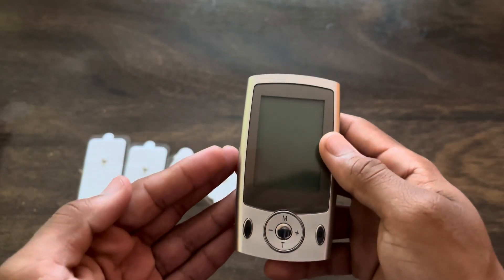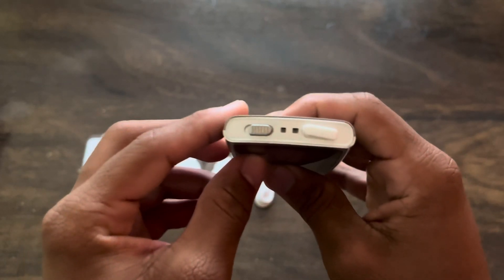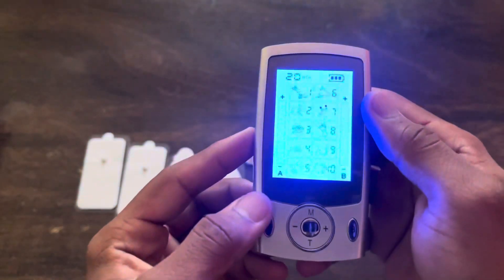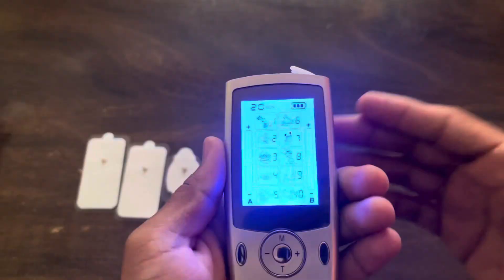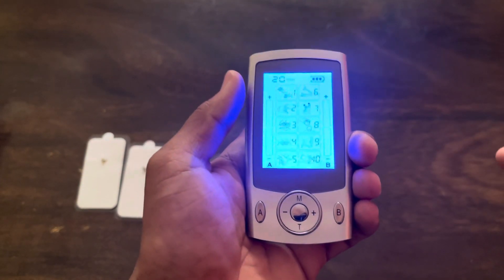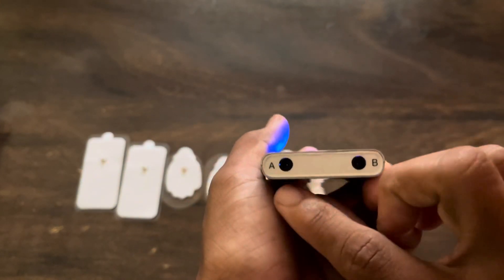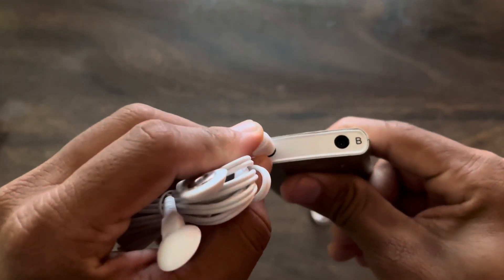Now let's see how to use this product. This is our TENS massager unit. At the topmost corner as you can see, there is one button to turn the unit on and off. When you slide this button towards the left side, the unit gets on. Beside this button, there is one port to charge the unit. There are two ports, port A and port B, and the cable gets attached into this channel in this way.